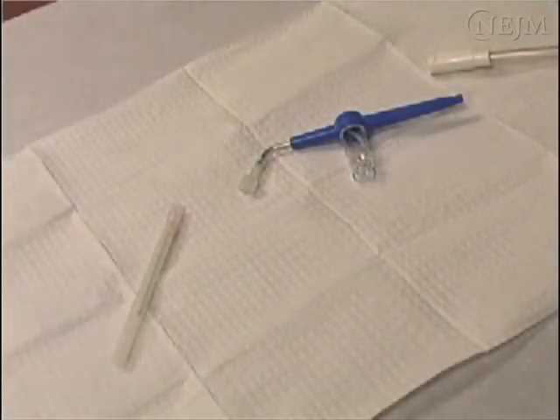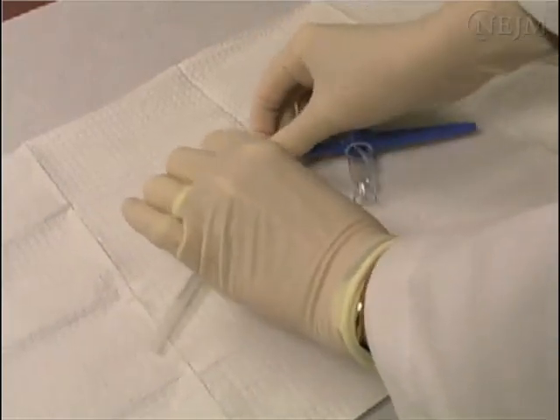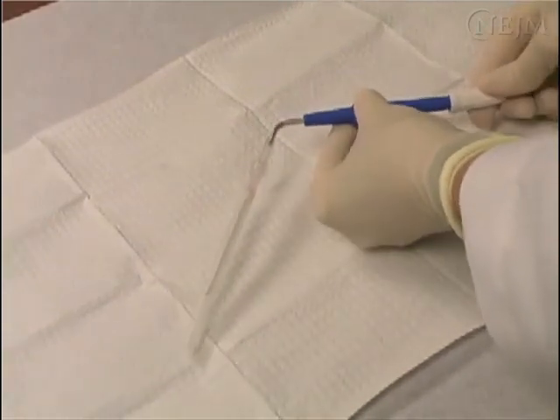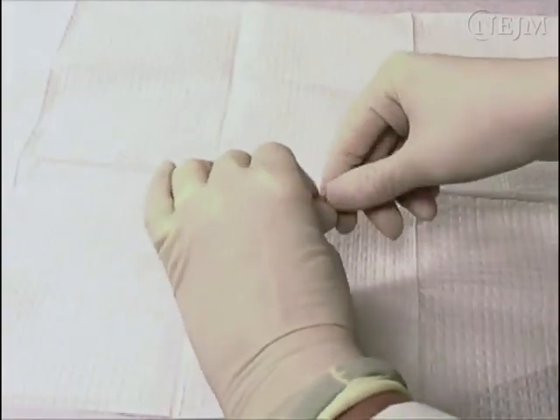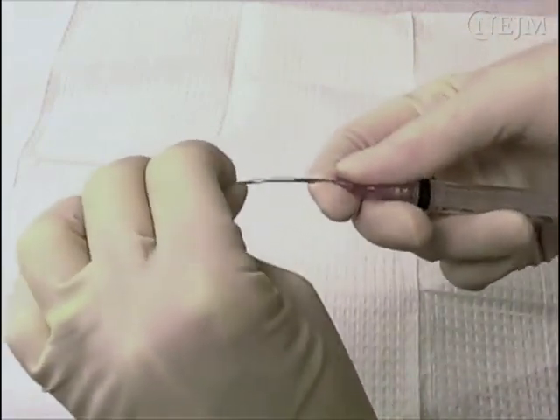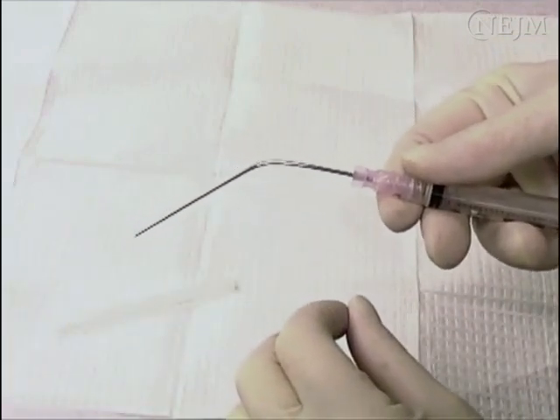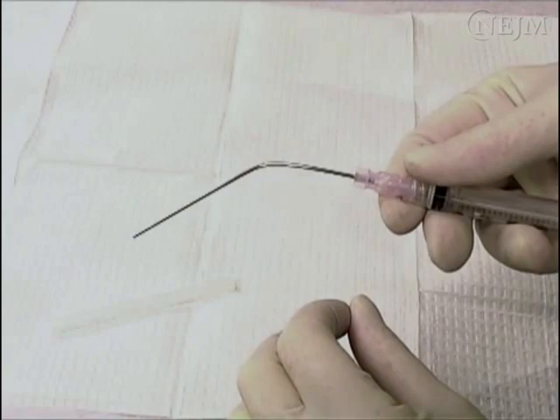Attach the needle to the tympanocentesis aspirator, then attach the aspirator to the suction device. If a tympanocentesis aspirator is not available, it is possible to use a 3-milliliter syringe connected to a 3-inch 18-gauge spinal tap needle that is bent at its midpoint to a 30-degree angle. However, given the manipulation required to bend the needle and the relatively weaker suction achieved when using a syringe, this is not the preferred method.